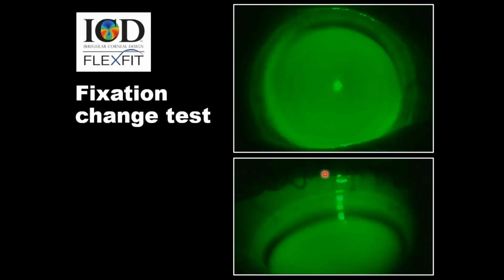Well, what you're going to do is the fixation change test. We see in this patient what appears to be heavy bearing down on 12 o'clock through the nasal aspect. So we ask the patient to look in the opposite direction, look down, and notice how that lens shows a real ring of touch. By decentering fixation, it hasn't eased that pressure on the peripheral cornea and limbus. So therefore, we need to adjust the lens. Call up the consultant and order limbal clearance zone +5.